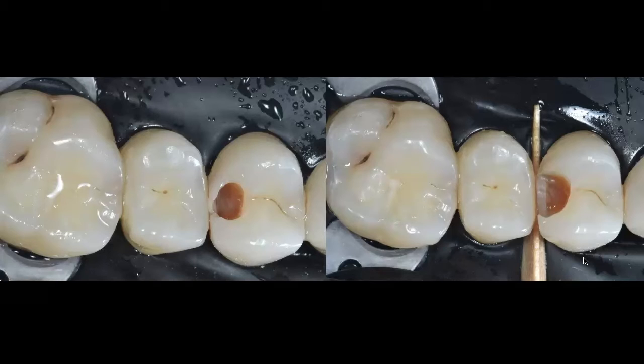And I tell my patient, you're going to feel a lot of pressure in this area. They're not going to feel any pain because they are numb, but they are going to feel a lot of pressure. And by creating that additional pressure, what I'm trying to accomplish is a little bit of orthodontic movement of these two teeth that are very close to each other. And by creating that, I'm actually probably creating maybe a quarter to half of a millimeter space in between the teeth, and that's going to allow me now to push that 245 burr, that 330 burr, or that number 2 round burr, whichever burr you decide to use.